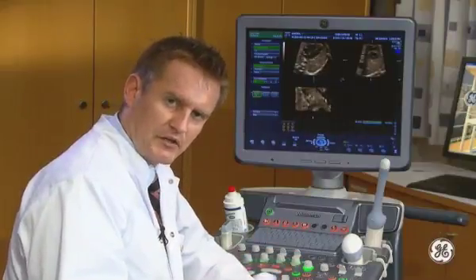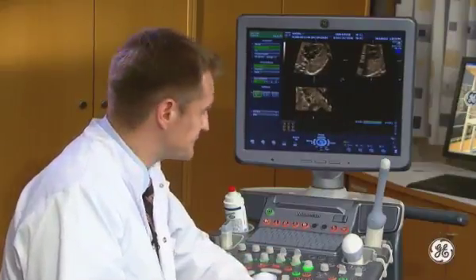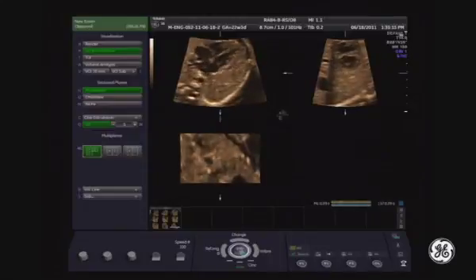So let's start with the process of orientation. Just after the acquisition, the fetal heart is beating with 100% of speed. You can reduce it, and then it will be easier to read. Normally, we do it with the speed of 50%.